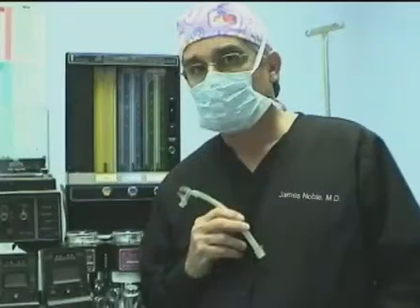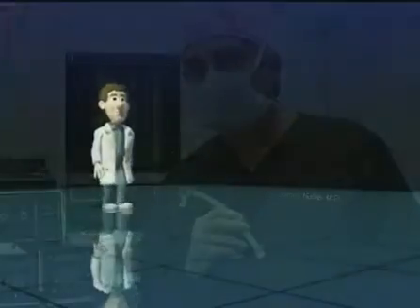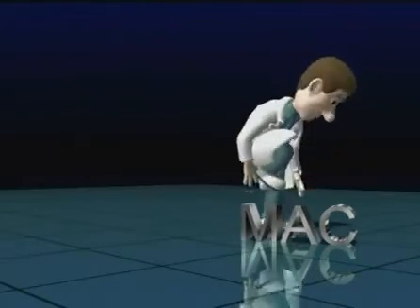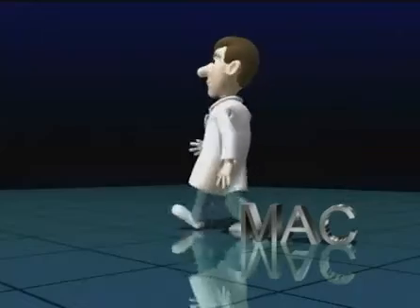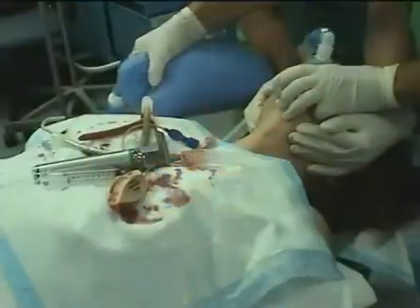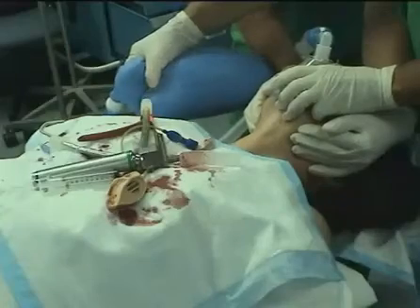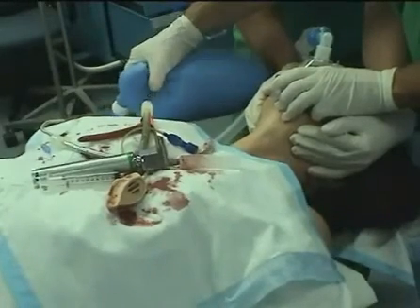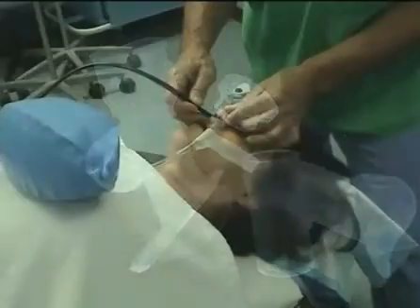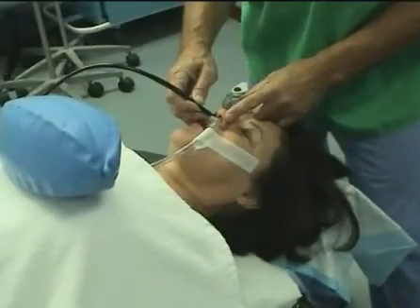An experienced anesthesiologist will recognize those areas in his own practice where there is room for improvement. As examples, consider the monitored anesthesia care, or MAC, that too often slips into deep sedation with airway obstruction and hypoxia. The fire risk of delivering 100% oxygen by nasal cannula through or near the surgical field. The paradoxical nightmare of can't intubate, can't ventilate, resulting from intentionally depriving the patient of spontaneous respiration in order to establish an artificial airway.